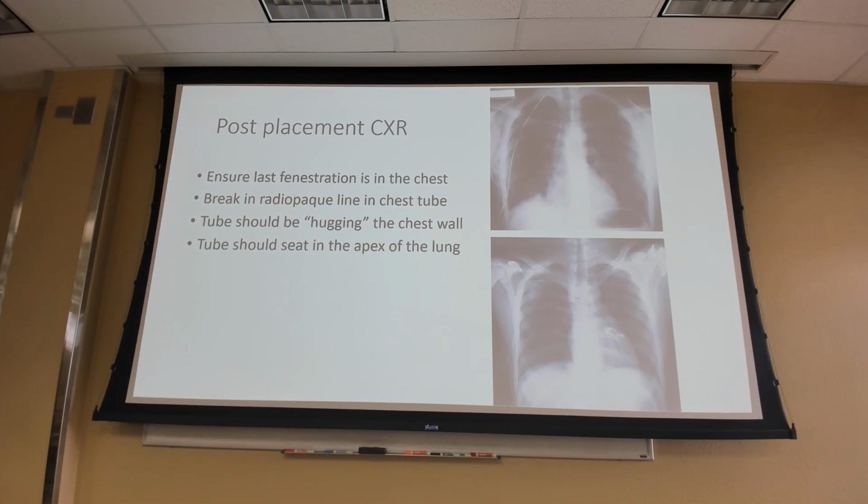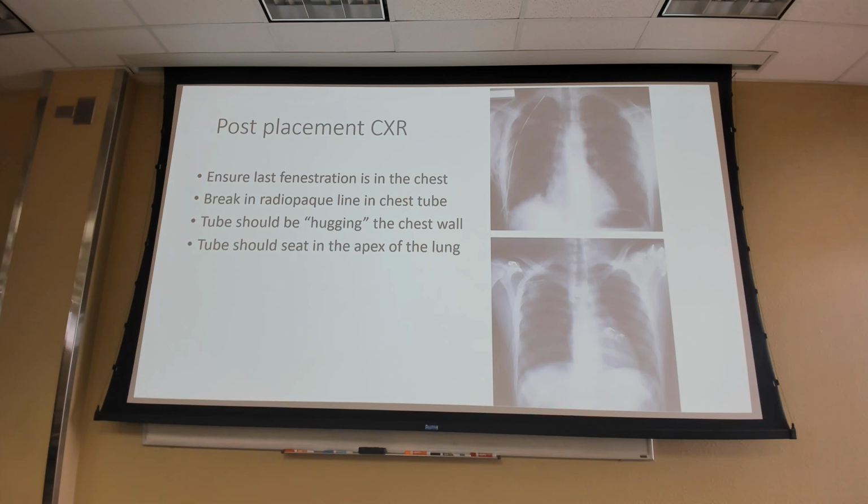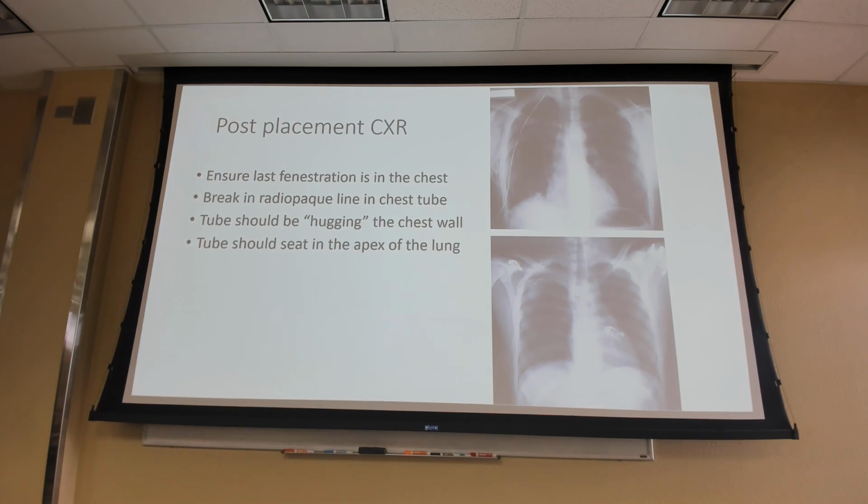And sometimes things do happen. Like I've had a chest tube that goes into the thoracic cavity, but it hits likely somewhere on the lung and then angles down halfway in the chest. So it's in the pleural cavity, kind of the correct place, but something happened where it bent that tube to go inferiorly, which is less than ideal. So we had to fix that. It happens. The most important thing is that that tube is not in the diaphragm or the liver or the stomach.